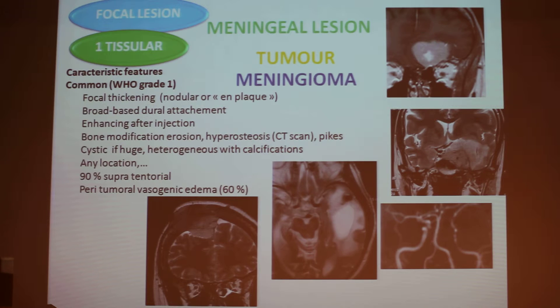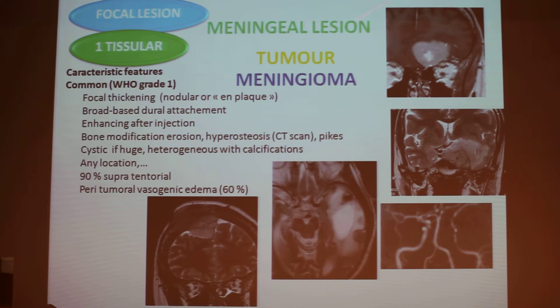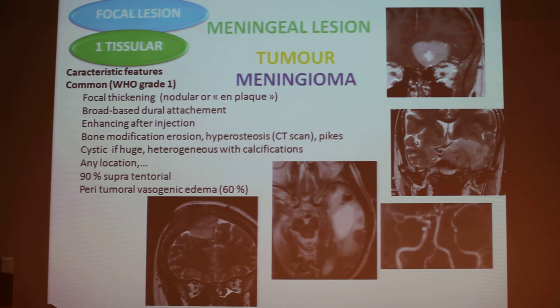When the meningioma is large it is often cystic; it can have calcifications which are very well seen on CT or MRI. This is a cystic meningioma with a very large cyst, calcification, and edema. It can have any location even if most of the time it is supratentorial. Edema is present in more than half of meningiomas. Often in meningioma you can see little channels. In a cavernous sinus meningioma there are two different layers — the external layer is often clearer than the internal layer.